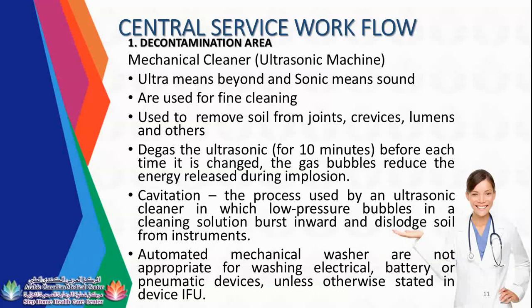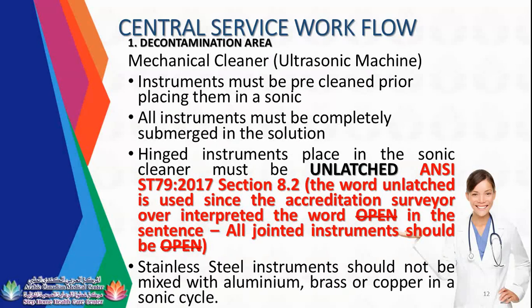Before putting instruments in the ultrasonic machine, instruments must be pre-cleaned prior to placing them in the sonic. So you need to do the manual brushing first. All instruments must be completely submerged in the solution.